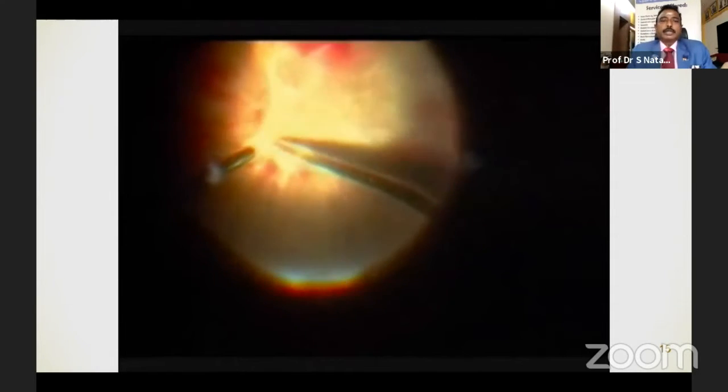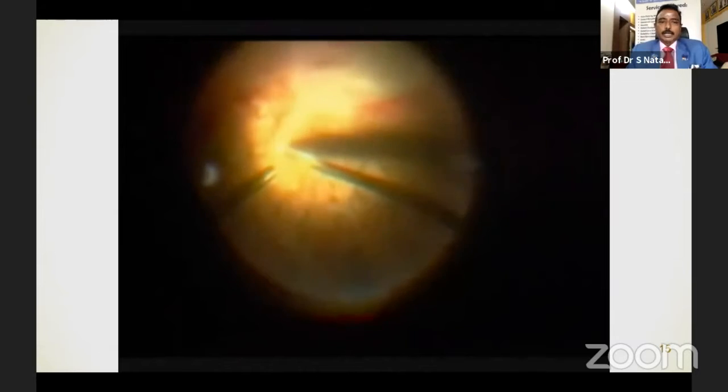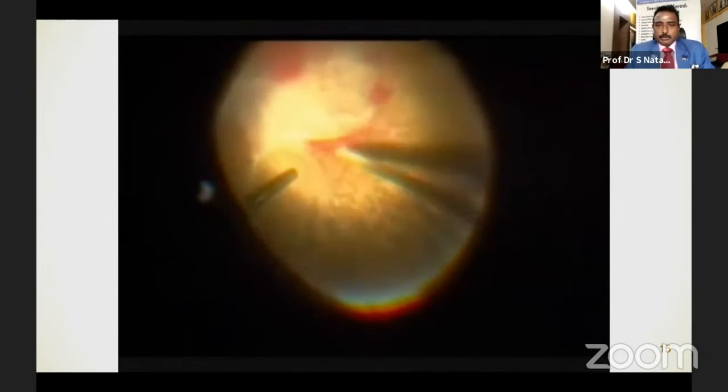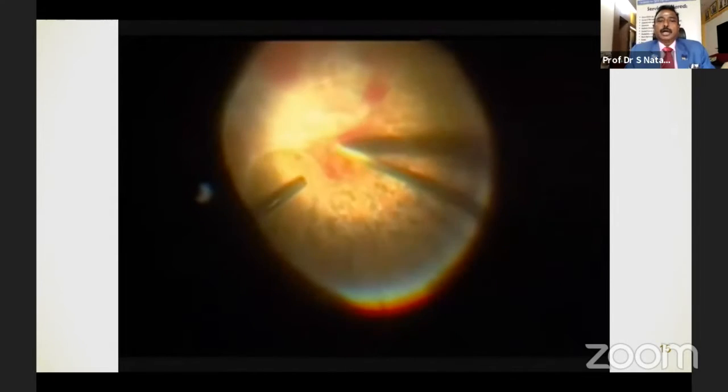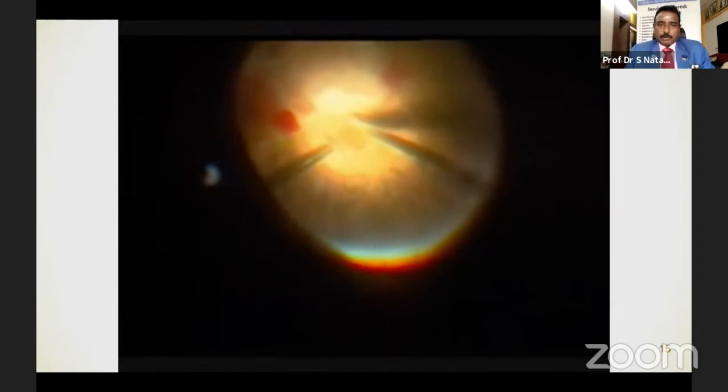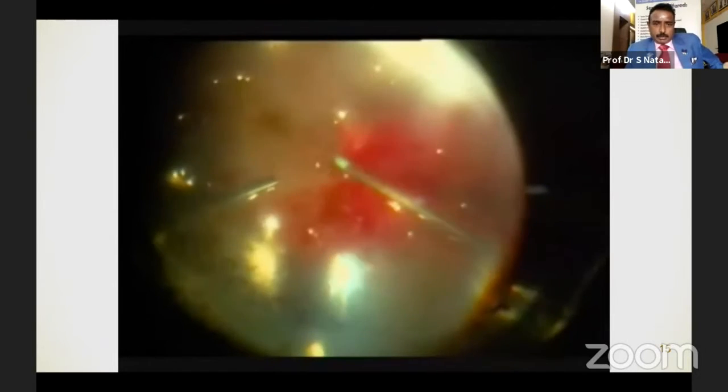Only thing is you can see that again I'm using the proportional mode to push the fluid between the membrane and the retina, and you can see the membrane is extending from the disc to the periphery, and then here again I'm doing the same. You can see the fluid being flushed between the membrane, and you saw the blood gushing out. So it's actually creating a cleavage, and I think it's like using a gush of water as a blade of a knife. You can use it to clear the pre-retinal hemorrhage which happens, and then do a fluid exchange.